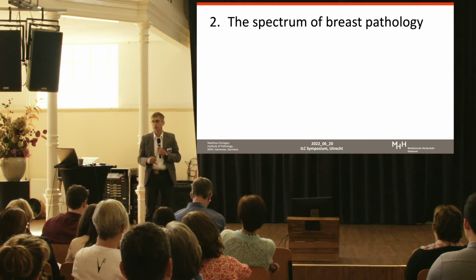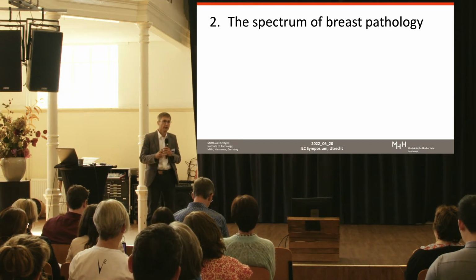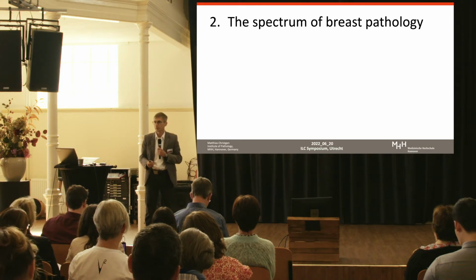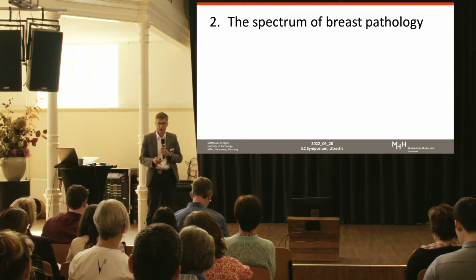I would like to show the spectrum of lesions encountered in diagnostic breast pathology, and I would also like to try to rank the relative difficulty of certain differential diagnoses based on the frequency of submissions of such specimens for second opinion consultation from local institutes in Lower Saxony to our reference pathology unit at the MHH.